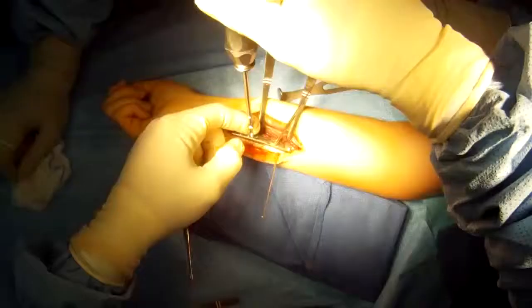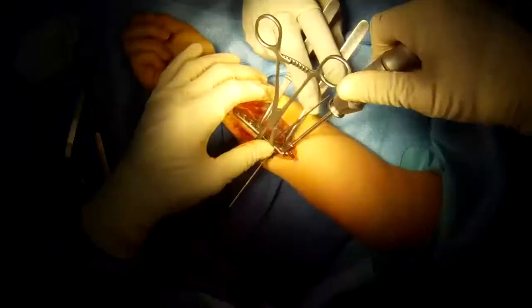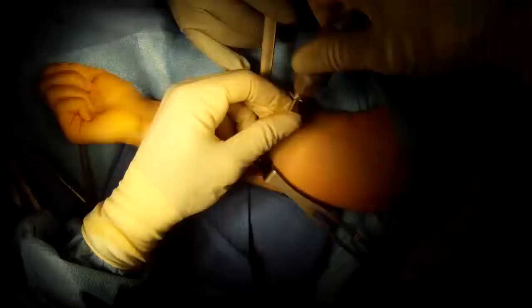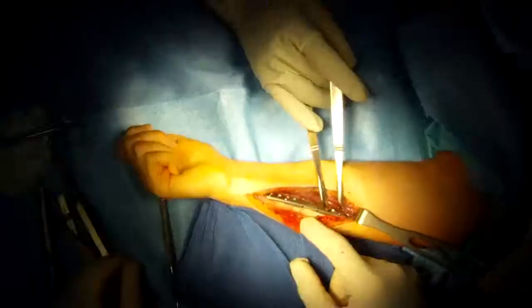Now we place an angled screw across the site where we cut the bone to hold the two bones together and provide very firm fixation and compression. We place extra screws to provide firm fixation. This entails six weeks in a cast.